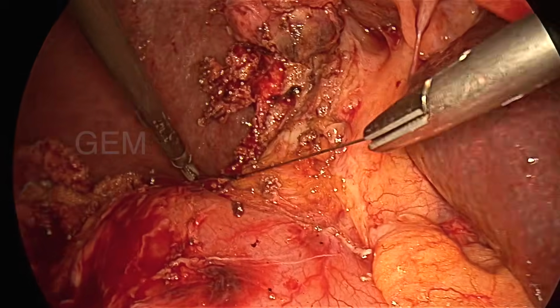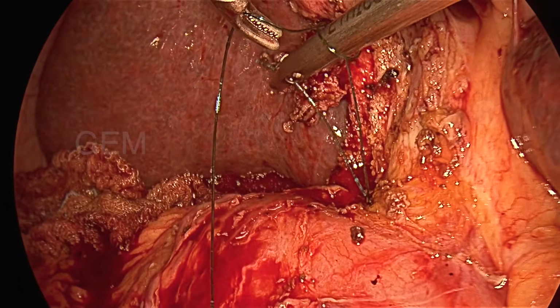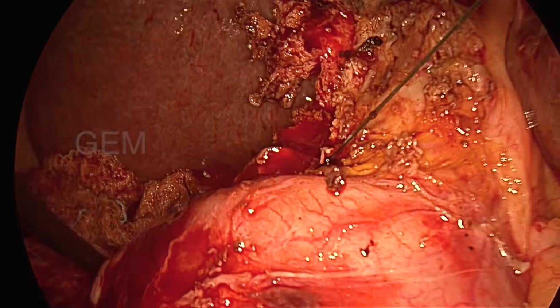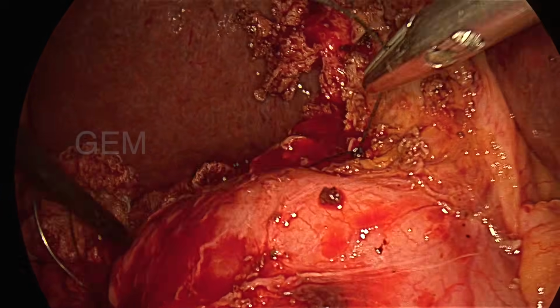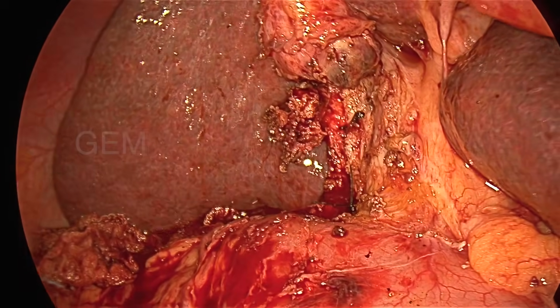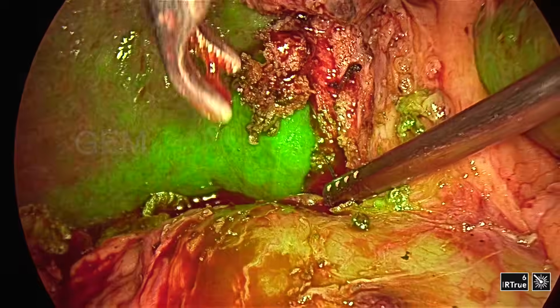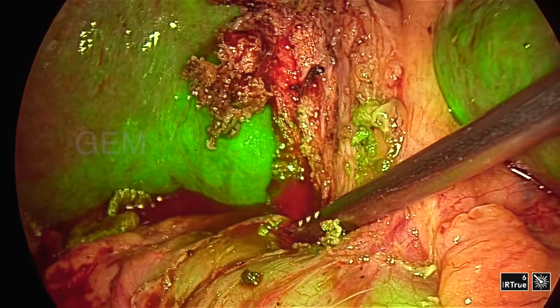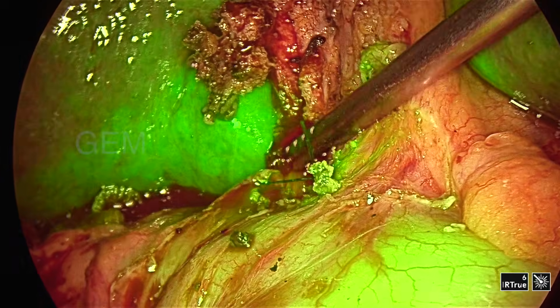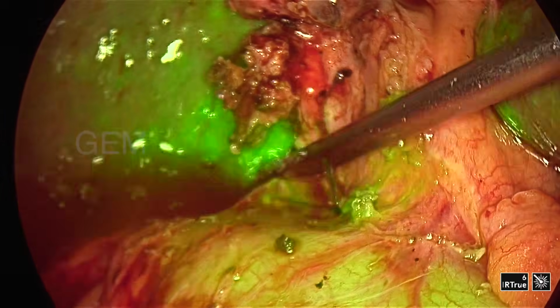And in this case, I don't know whether the CBD is stented or not. If it is required, you can do stenting post-operatively if there is a bile leak. But there is no bile leak post-operatively for this case. This was done recently, I could remember there is no bile leak. Even see the suturing site, after suturing there is no green color there.